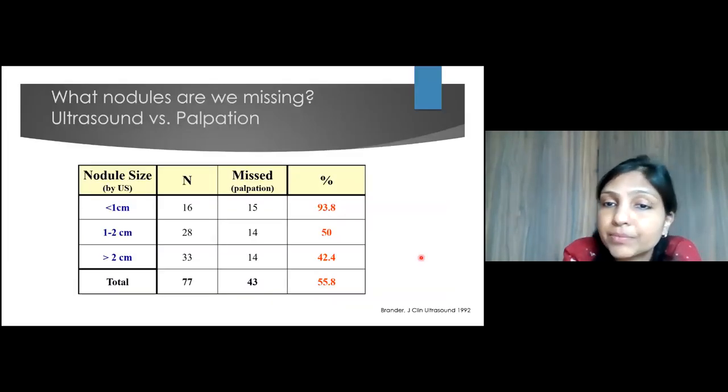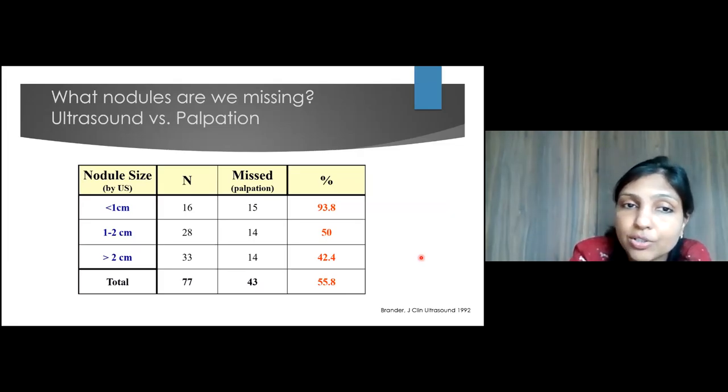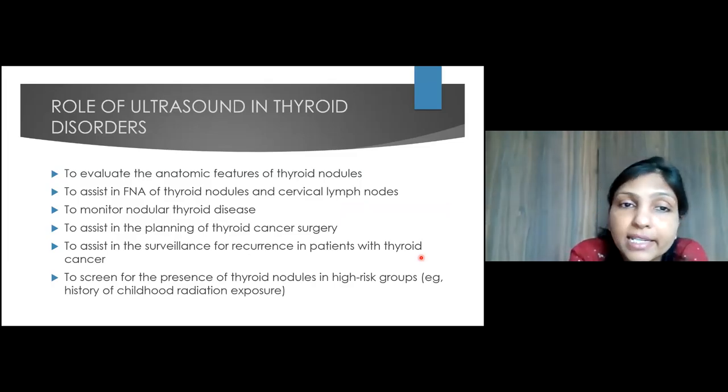So the data that we have today says that if you compare ultrasound versus palpation, there is a significant number of nodules that may be missed on palpation alone, amounting to almost 93.8% for nodules that may be less than 1 centimeter. So the role of ultrasound has been more defined these days.